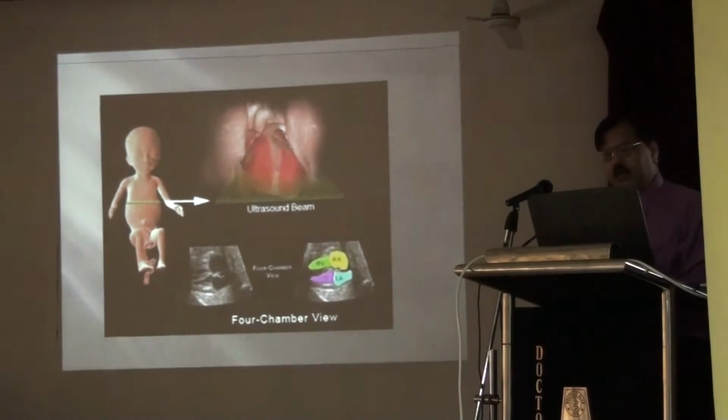Theoretically there are 100 points, but practically 20-25 points are the common clinical aids for that. And this technique is important. We have done 30 to 40,000 echoes here in the last 10 years, and for recorded echo, we don't have any waiting time.